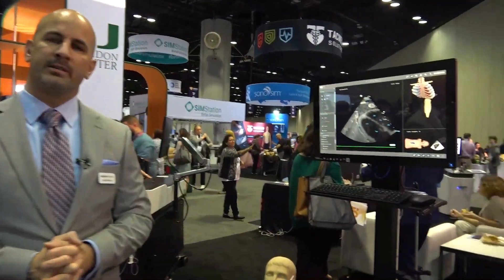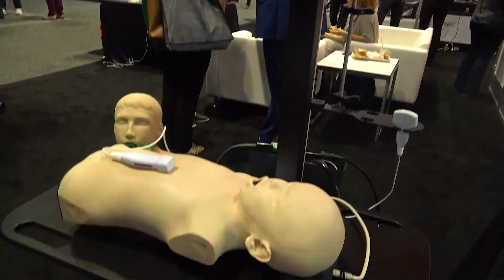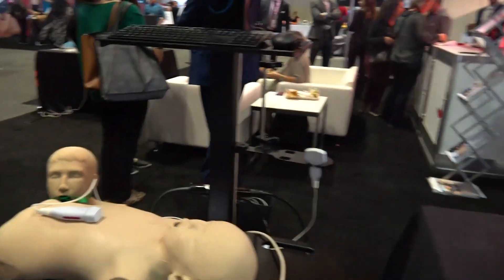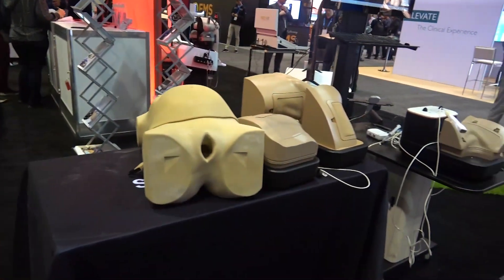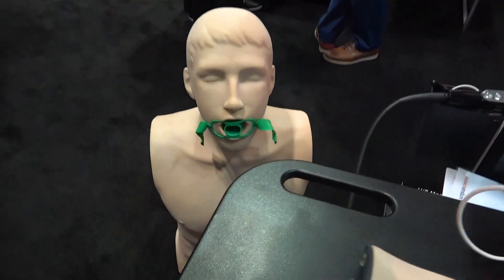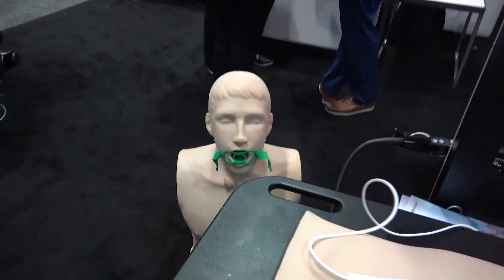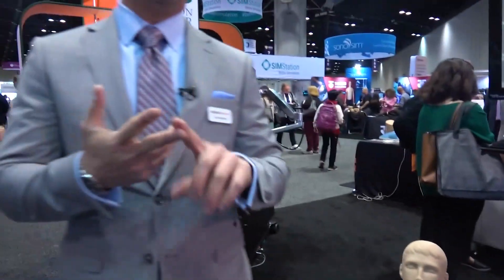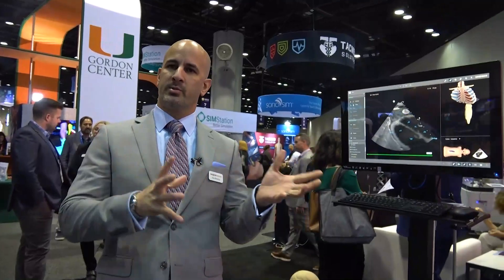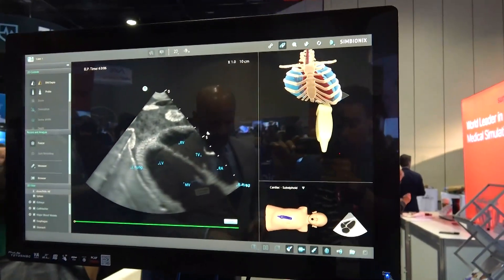This is our US Mentor ultrasound simulator, divided into diagnostic and interventional simulation. On the diagnostic side, we have a male mannequin covering a wide range of procedures including e-fast, rash, lungs, neck, abdominal, TE, advanced echo, and more. This allows doctors to practice on a very wide range of scanning protocols.